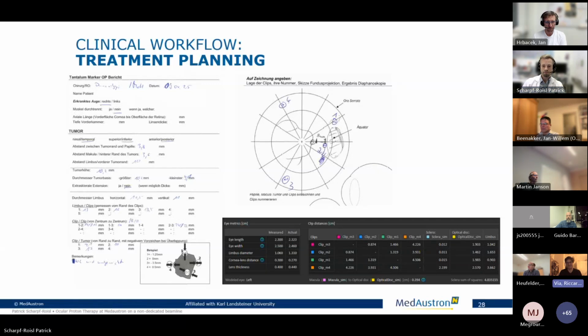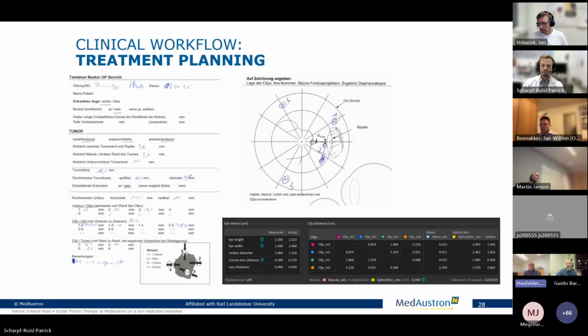Okay, thank you. Then we have a further question in the chat from Stefano Laurenti. Thank you for this very nice presentation and congratulations for your results on the scope. Two quick questions. First, what is the distance between the range shifter and the collimator? And second, what is the maximum aperture size you can mount on your applicator?